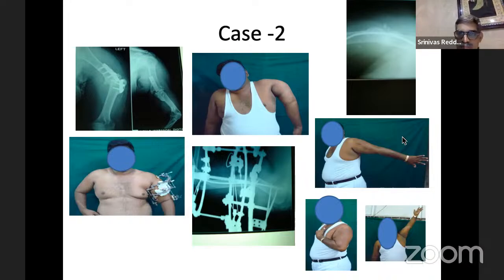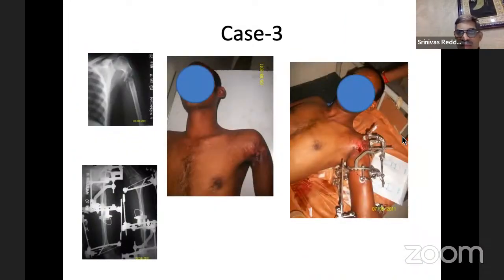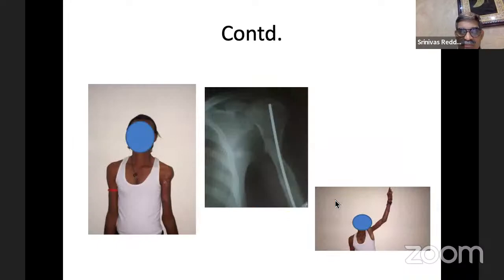Next case, and this is an infected non-union. This is with a lot of comminution, and a wound is there with the infection, and in a single stage this is done. Proximal half ring and oblique supports were applied, and this is the application. Next one, and united nicely. And generally the patient comes for the removal. If he asks for the removal, I remove this pin, otherwise we can keep it like that. And this is the range of motion. Okay, next one.